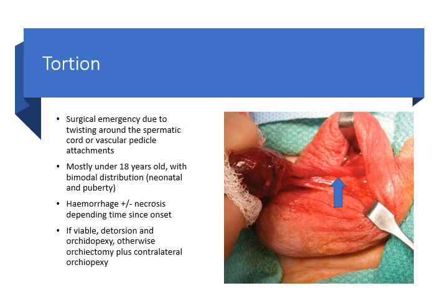You can actually see the twisting of the cord as shown there by the big blue arrow. The surgeon there holds the hemorrhagic testis. If the testis is still viable and doesn't need to be removed, then it is fixed back into the scrotal sac in place, and usually it's necessary to hitch down the other side as well, because that's also at risk of undergoing torsion.